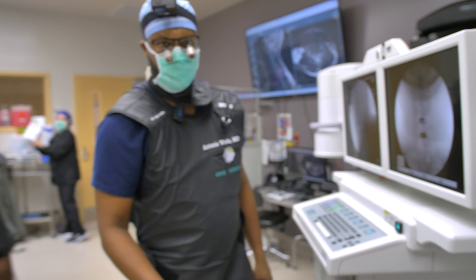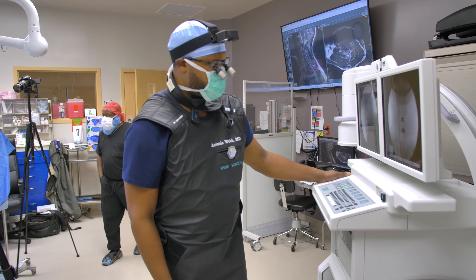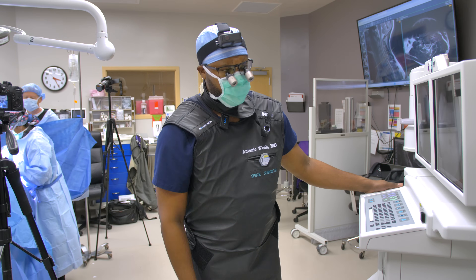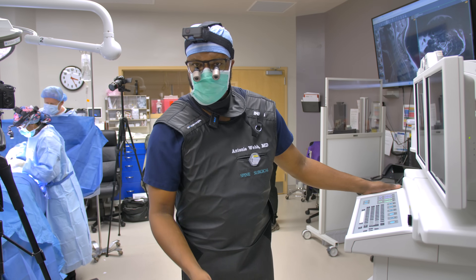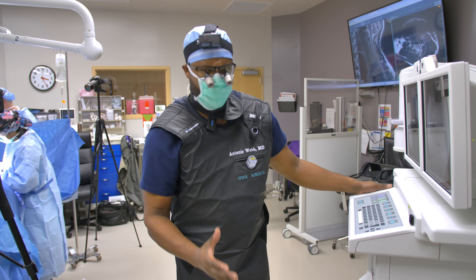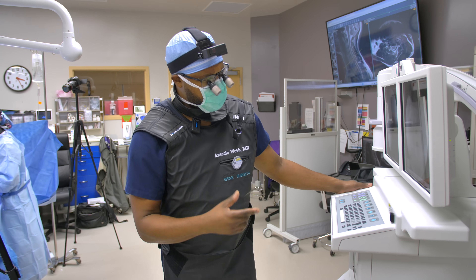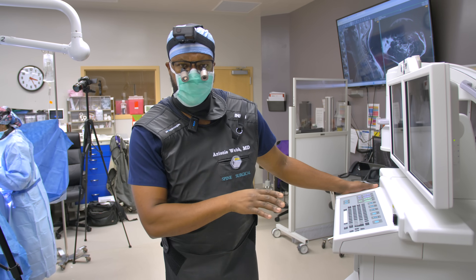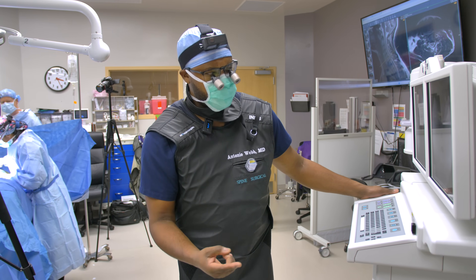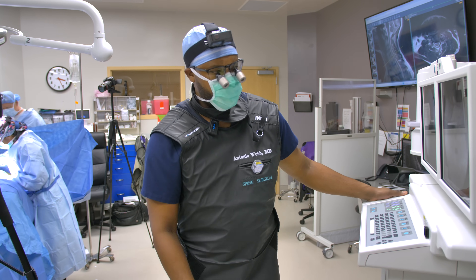Postoperatively, we'll get him up and start walking later this afternoon. Most patients that have this surgery are in the hospital for probably less than 23 hours. It's 3:30 in the afternoon, so he'll go home tomorrow morning. Recovery for this is about four to six weeks — quicker recovery than a fusion. There are a lot of different advantages to a disc replacement over a fusion: maintenance of motion, quicker recovery, and it decreases the chance that you'll need further surgery in the future.